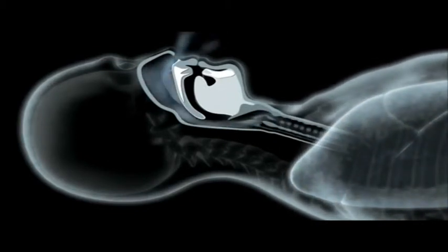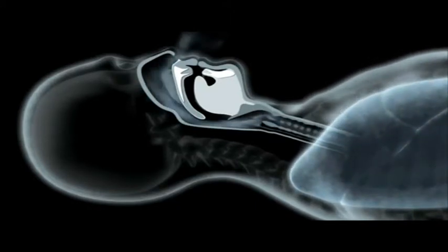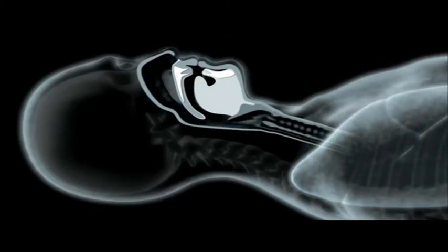During a central apnea, the airway actually remains open. There is still no respiratory flow, and blood oxygen saturation will fall, but the airway remains open. The patient's respiratory muscles make no effort to breathe during a central apnea.